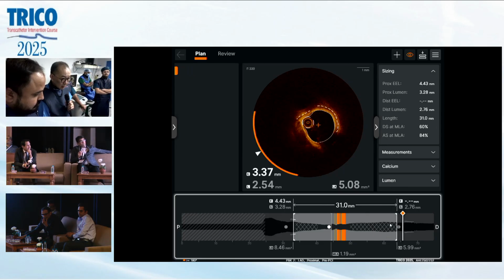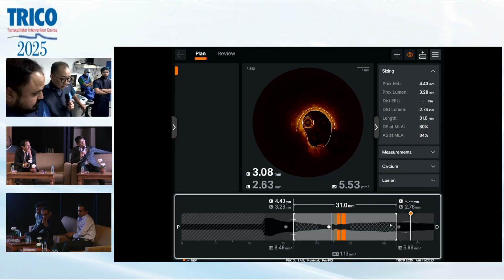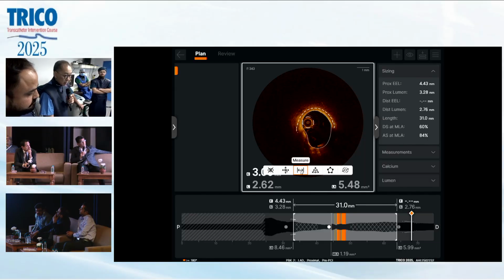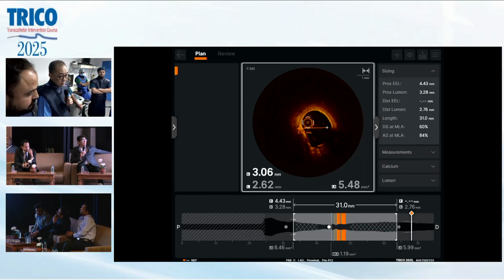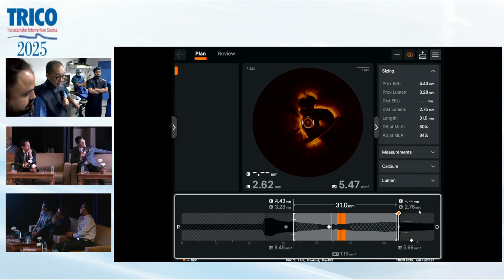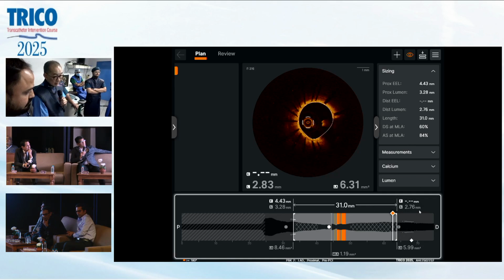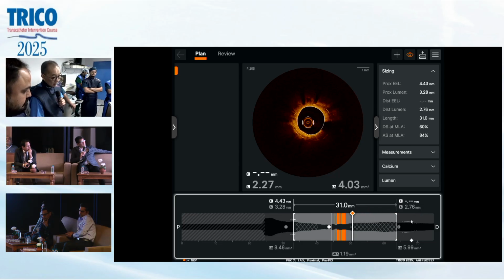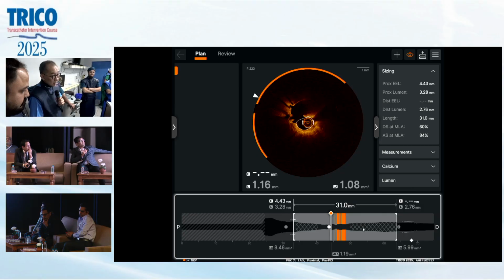In the distal healthy part where there is not much narrowing, what is the reference diameter there? Right, it's a 3.0 vessel in the distal. Right, and here it is also 3.0. Okay. Since it's inside a stent, we should probably start with the 3.0 NC, right? 3.0 by 15 NC. Okay, reasonable.